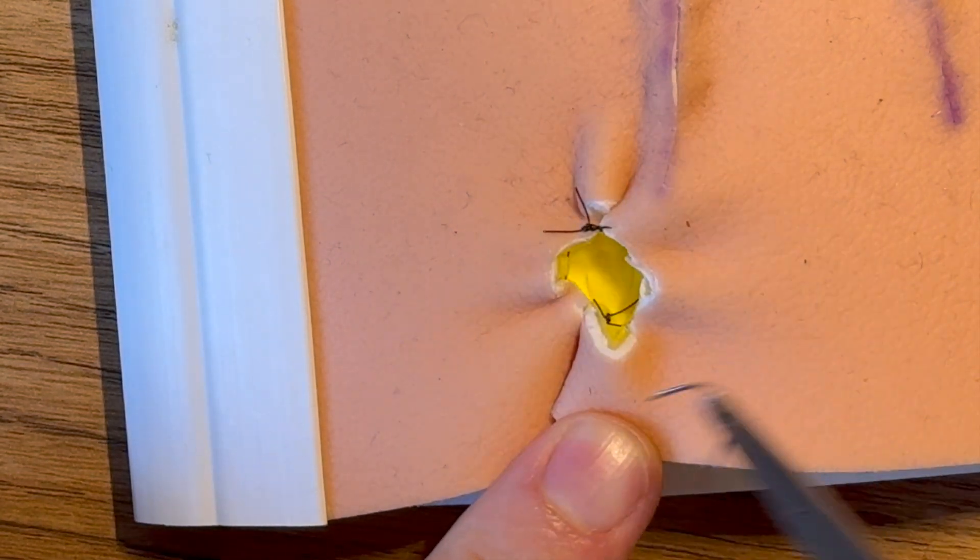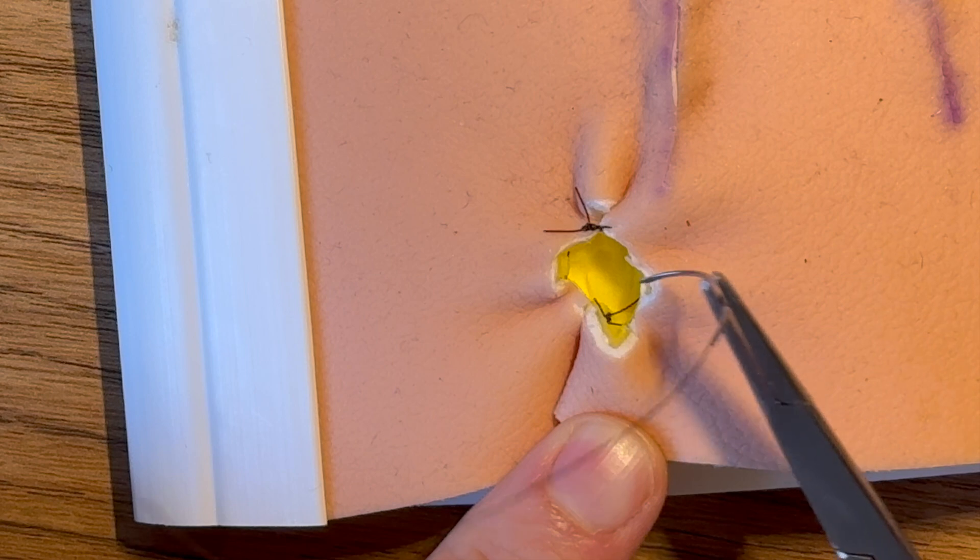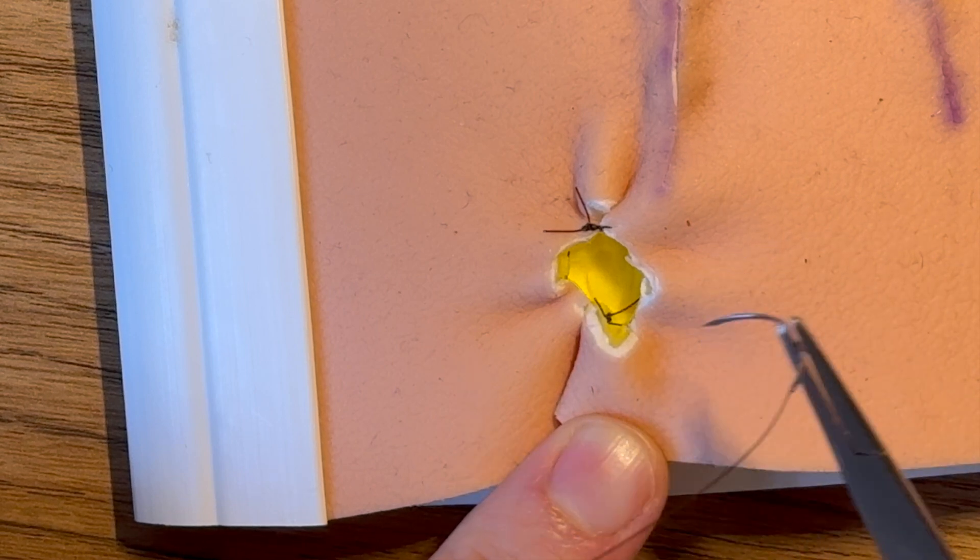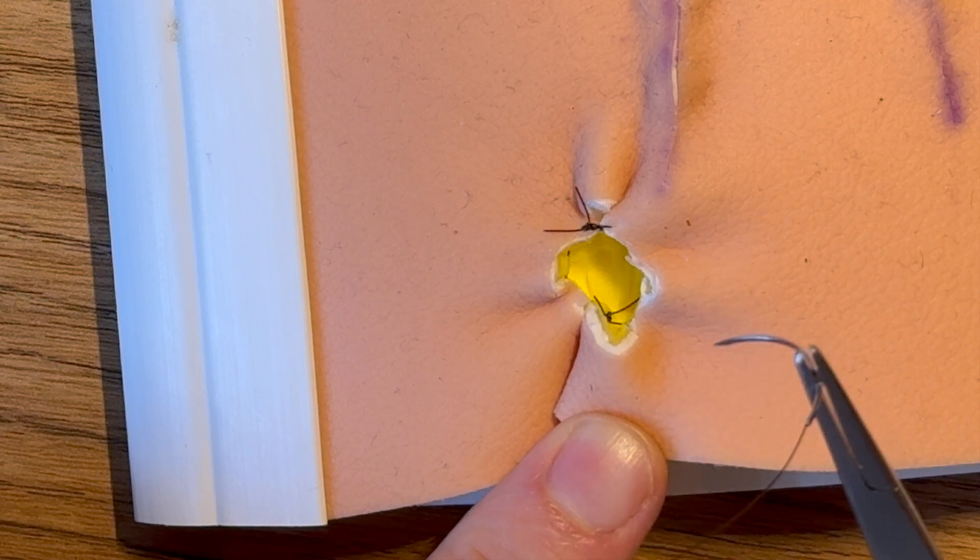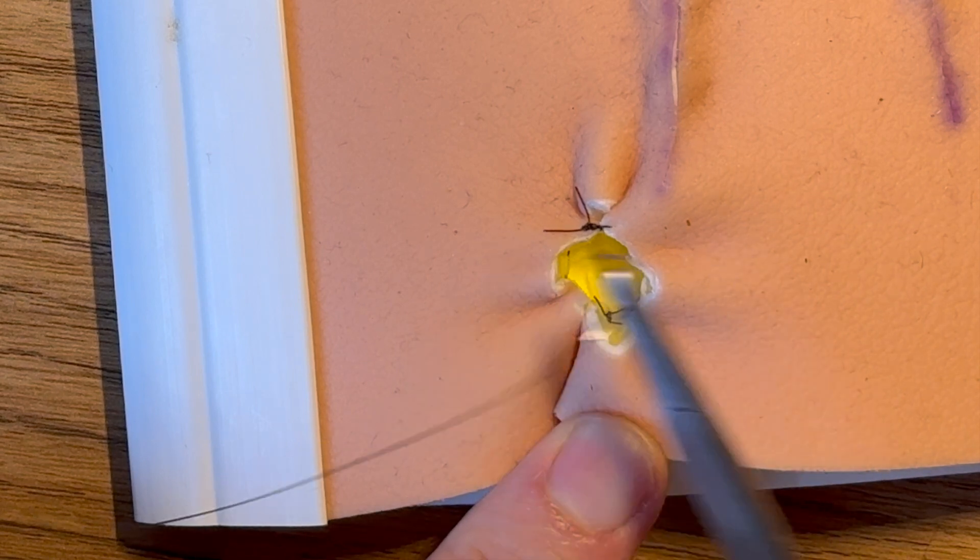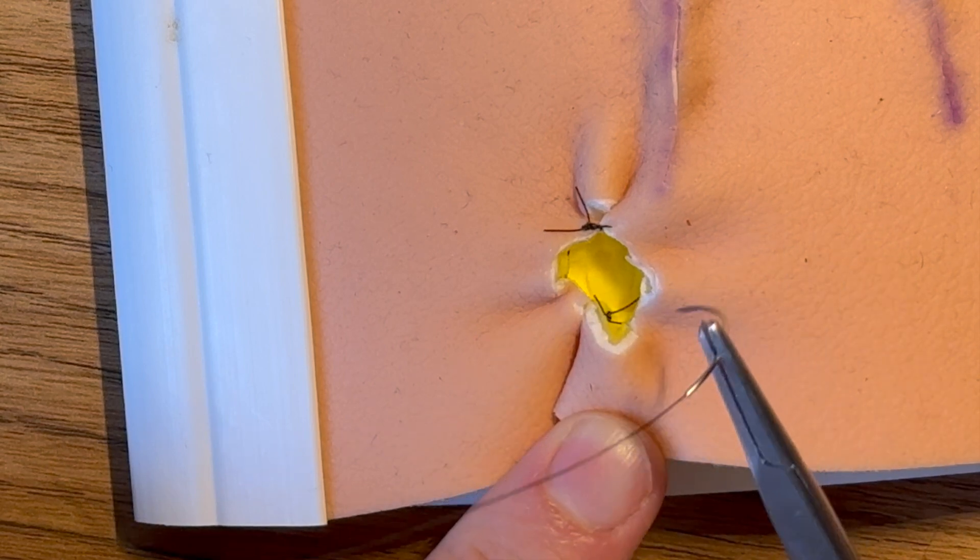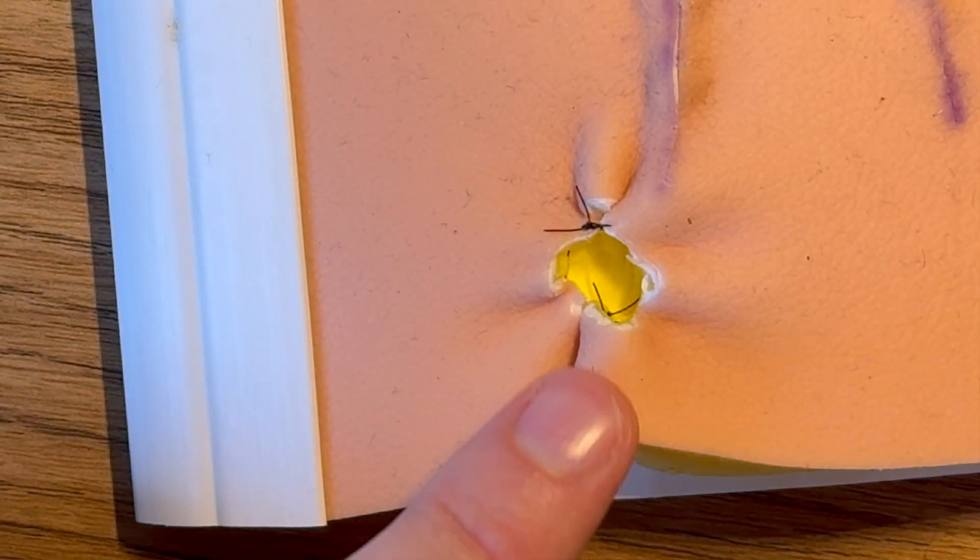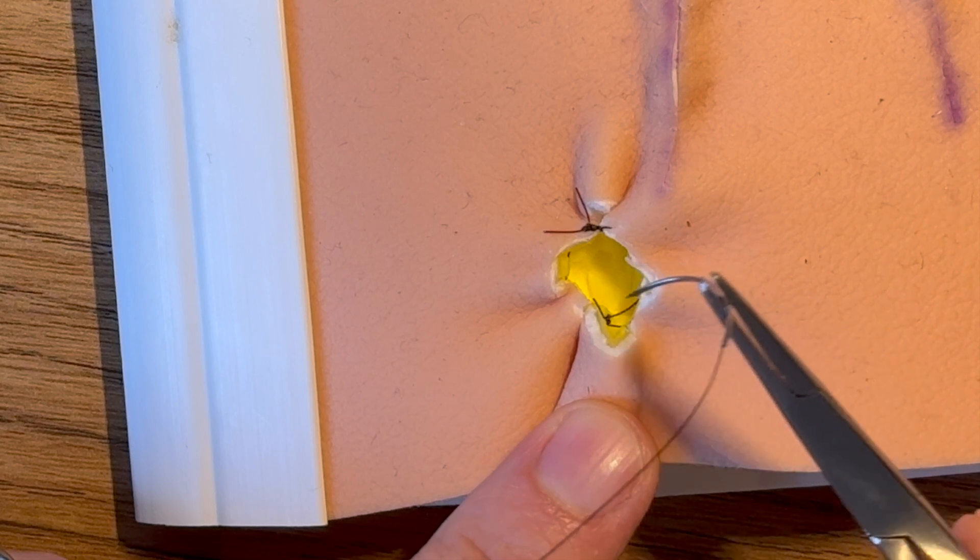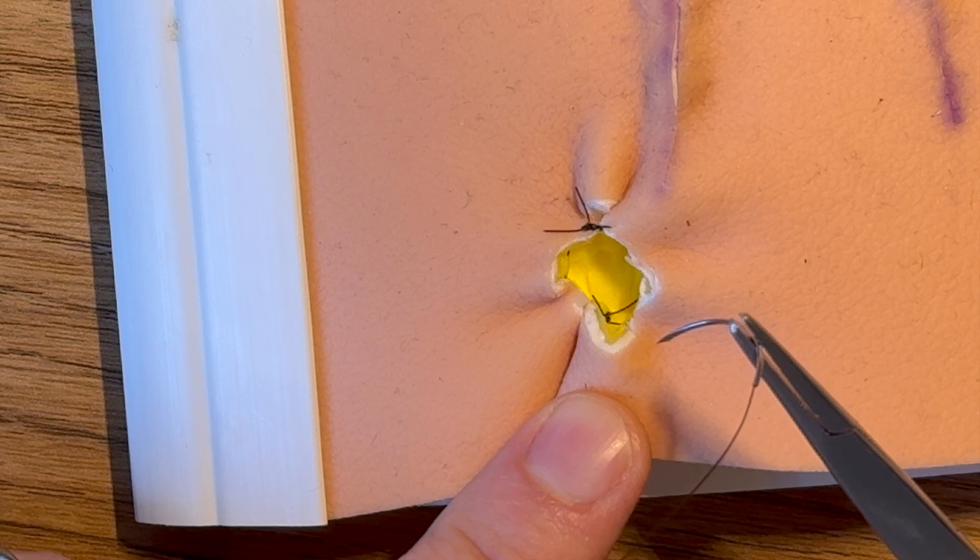So that's also particularly useful in a hair bearing area where you can't really graft hair very effectively usually. You can have a go, if it doesn't work that well and you don't want a hairless graft in a hair bearing area of scalp. So actually doing secondary intention healing, the scar is going to contract and draw the wound edges together which is going to produce a much better end result, a smaller patch of hair loss than if you put a graft in.